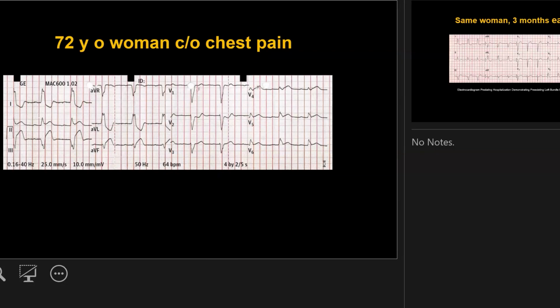Hey, I guess one more quick question. When you showed the AFib with the rapid ventricular rate, there were ST depressions in some of the V leads on that EKG, and you didn't mention anything about rate-related ischemia, how concerned someone should be, because they disappeared when you controlled the rate on the following EKG. Can you comment on that?